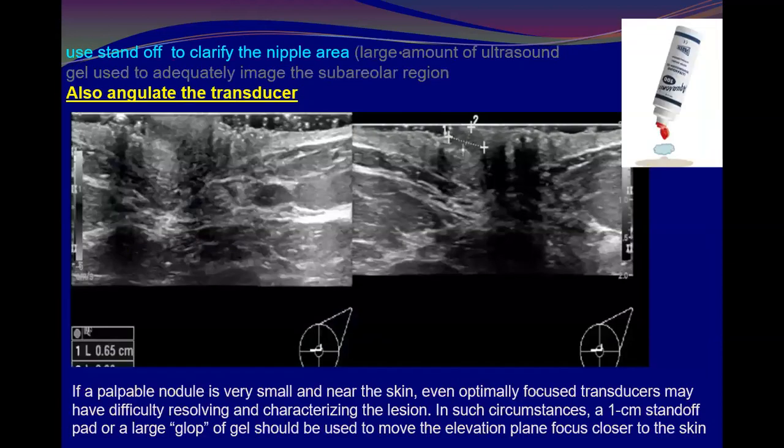This is my patient having a lesion within the nipple. If I remember, it was a nipple adenoma. By using a large amount of gel, we could clarify it.